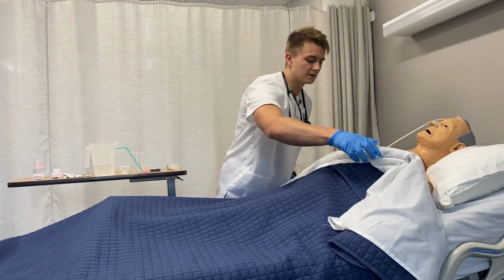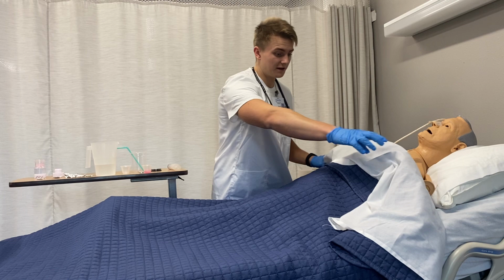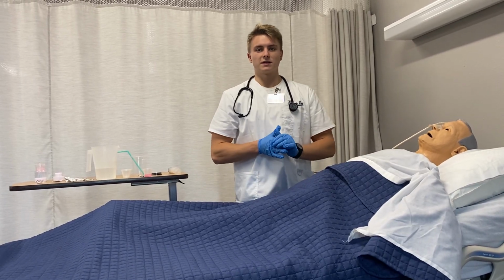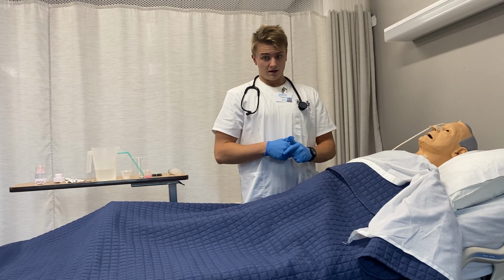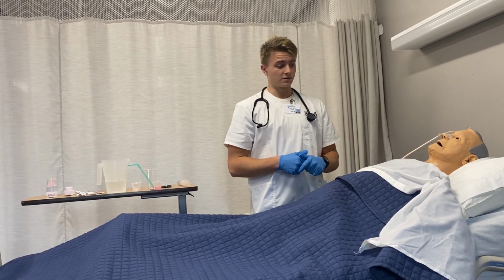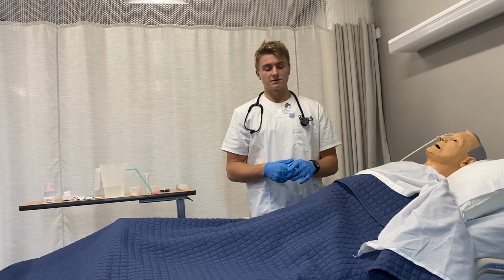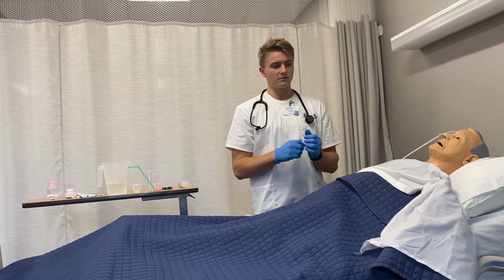Tell Jim that they sound fine. And now what we're going to have to do is check placement. Now checking for placement is done both post insertion of the tubing and prior to administering medication. So from now on, I will be going back to medication administration.